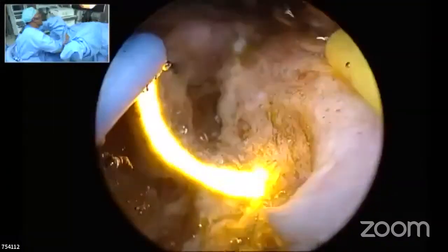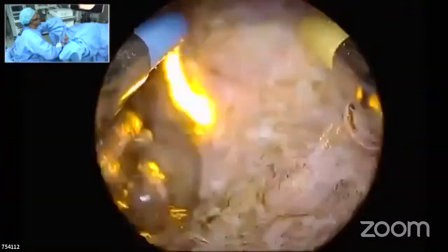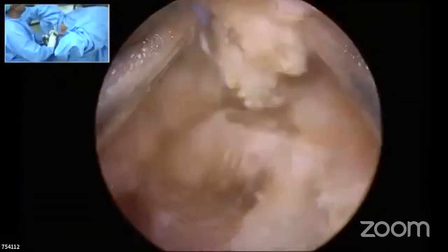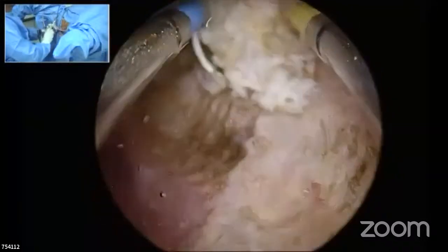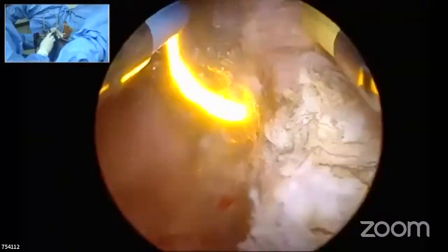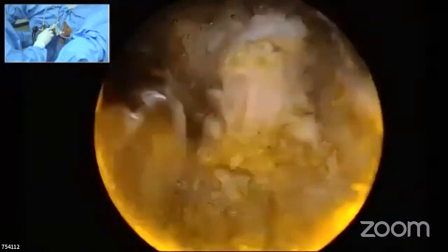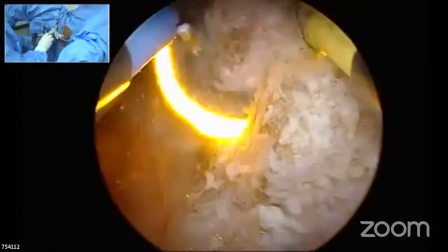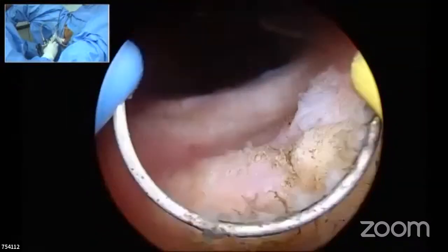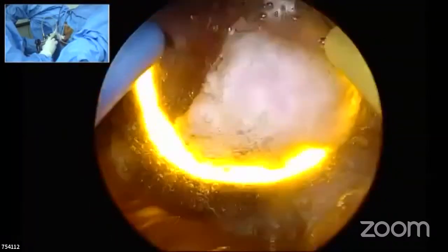So this is what I was looking at. I showed how the bands technique started. It starts with the floor and goes towards the sides and comes up, and you come from above downwards and again from below upwards till you reach the capsule. That is the idea. What was said when we were trained was, if you have a difficulty or end up in a problem in between, you can stop the procedure and come out. Having debulked a significant amount of the gland, by the time you reach the capsule, possibly you may not require any more procedure. The patient may be able to pass urine. That is the concept of why the whole thing started.